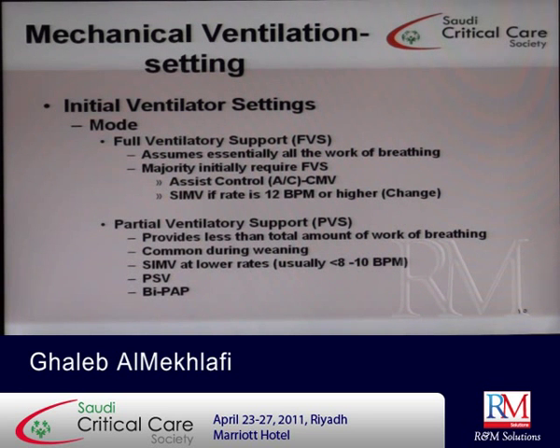And here you can use either pressure control, assist control, or SIMV. If the rate is high, it will become like assist control. SIMV, if the rate is high, it will become like totally control. Okay. In partial ventilator support, you provide less than the total amount of work of breathing, and it is common during weaning. We usually use these modes, which include SIMV, pressure support ventilation, and BiPAP.